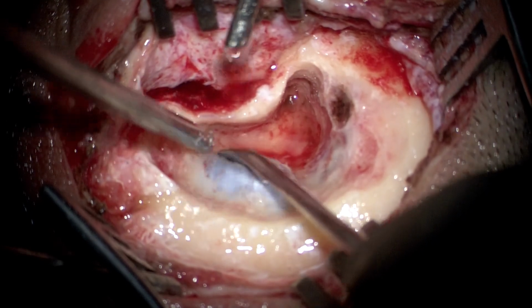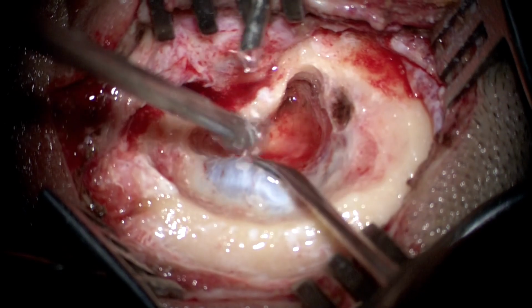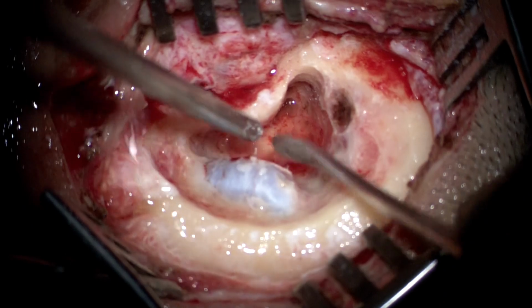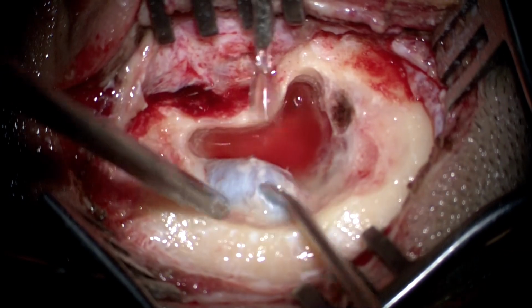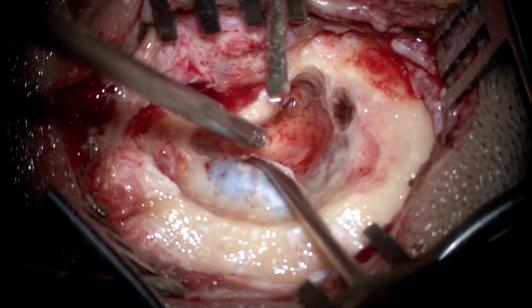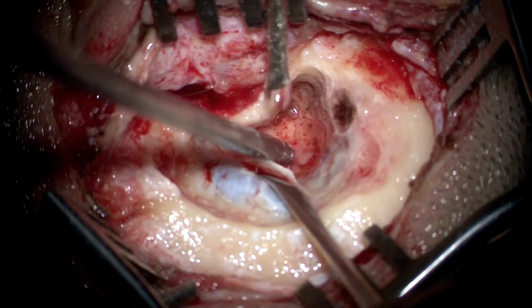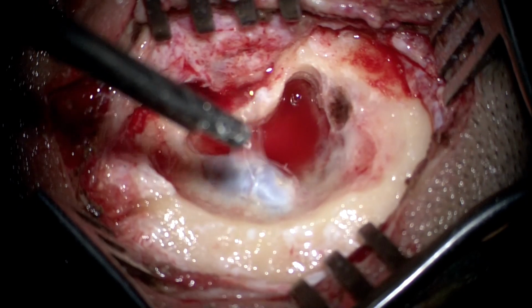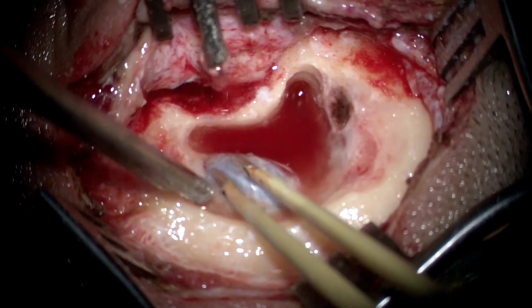So we can see here how much bone anterior to the sigmoid sinus is there, which could later on be drilled once we have decompressed and pushed back the sinus slightly. So one can really notice that even 10 millimeters of excess bone exposure that we achieve by doing this step is extremely valuable while drilling the entire length of the posterior semicircular canal.